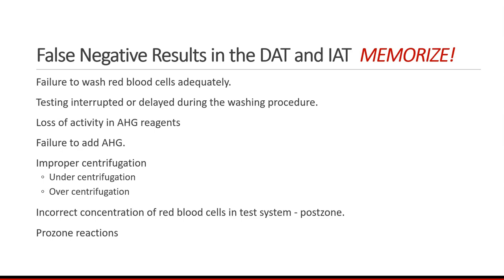Failure to add AHG. And you'll notice that the Coombs serum that you're using is green. And this is because this was a real problem. I can tell because of my experience whether or not I've added Coombs reagent. I can tell because the volume is different. But as a newbie in the field, you may not.